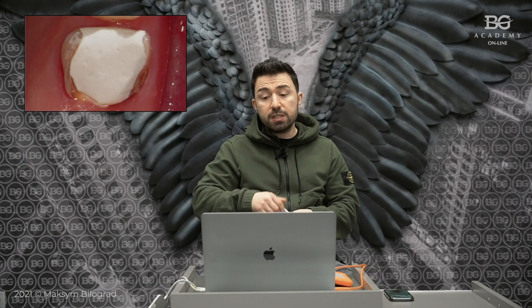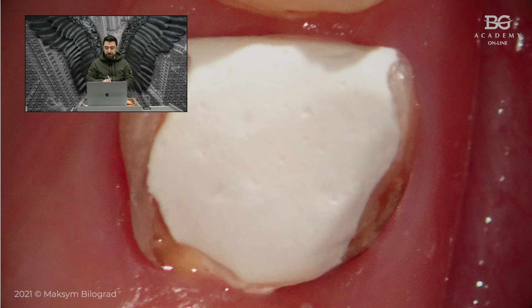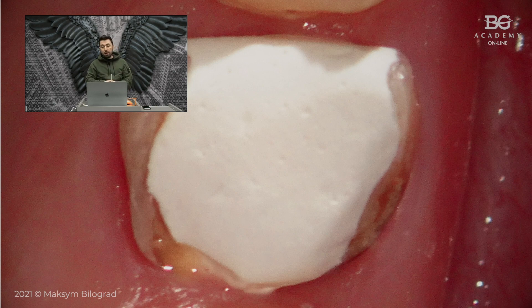The patient went to another clinic for root canal re-treatment, and afterwards she came back for the restorative part with a temporary filling. So you can see now the temporary filling after re-treatment.